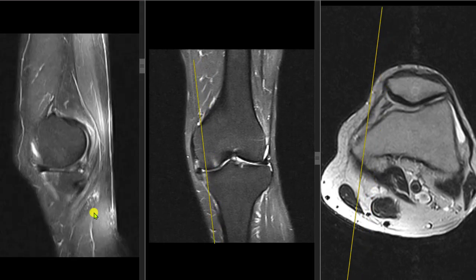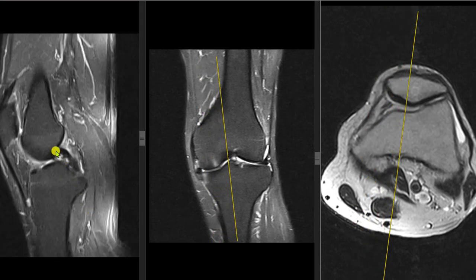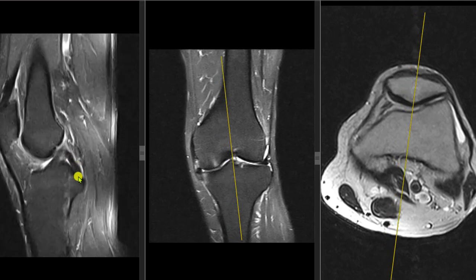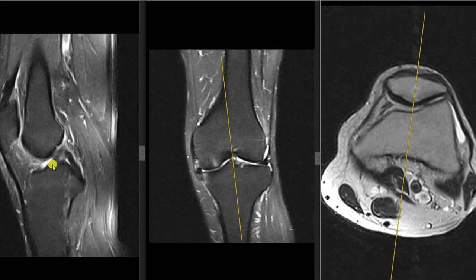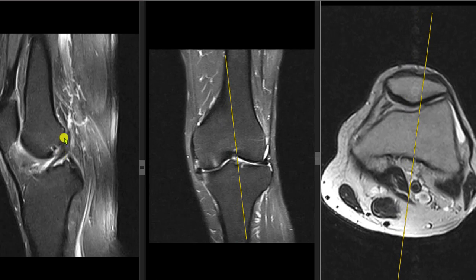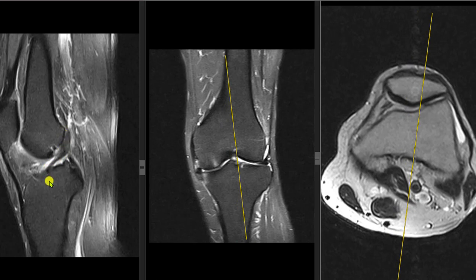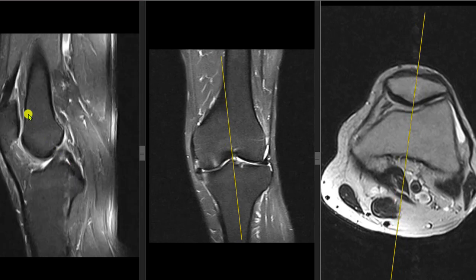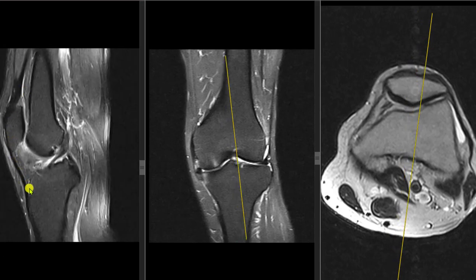Here we can see the upper portion of the posterior cruciate ligament, and this is the mid and lower portion. We can see the lower and mid portion of the ACL, and this is the upper portion of the ACL. The entire length of the ACL appears normal, while the PCL is normal as well.